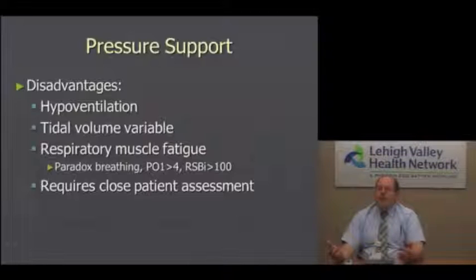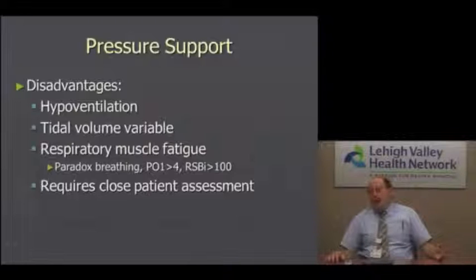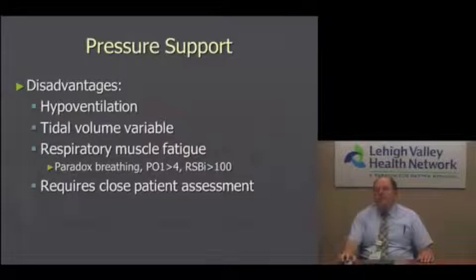And EMG studies have shown if patients develop muscle fatigue, it takes anywhere from 48 to 72 hours for the diaphragm to recover. So you can take the proverbial one step forward and two steps backwards if you don't manage patients correctly on pressure support. I think it requires close patient assessment. Sometimes it's easier to give a patient some joy juice, knock them down, and then have the ventilator do all the work. I think sometimes this mode of ventilation is looked upon as a weaning mode, a secondary mode, but in some ways I think it's very, very important, especially if they're on high levels of pressure support.